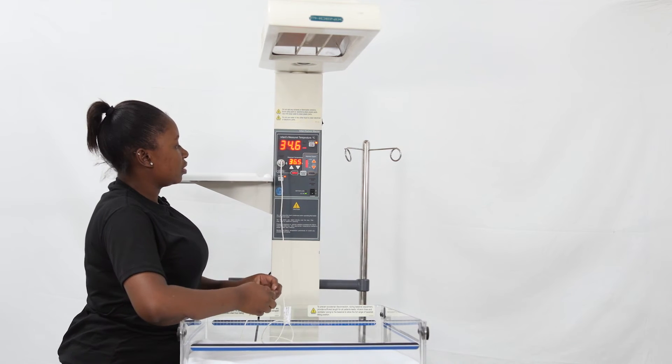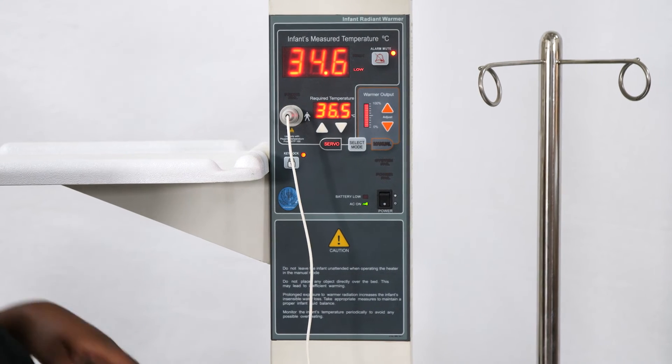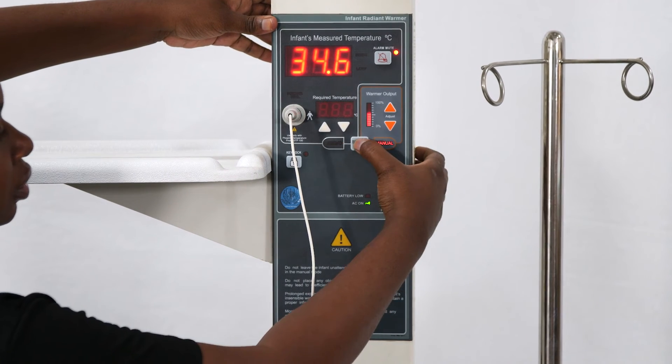Now let's look at how manual mode works. To switch back, first turn off the lock. Then press select mode and you're back into manual.